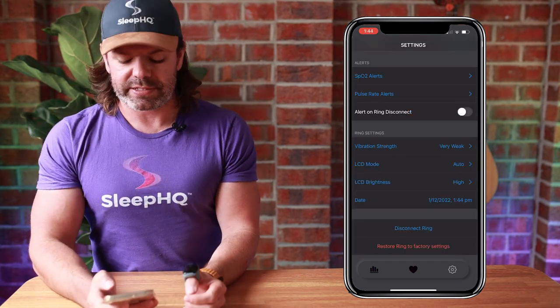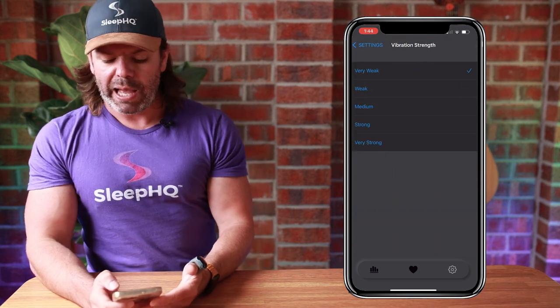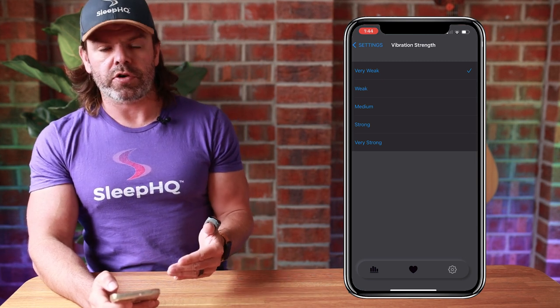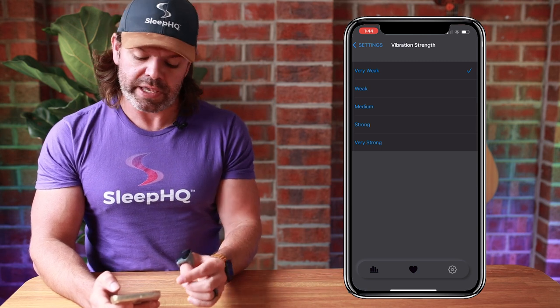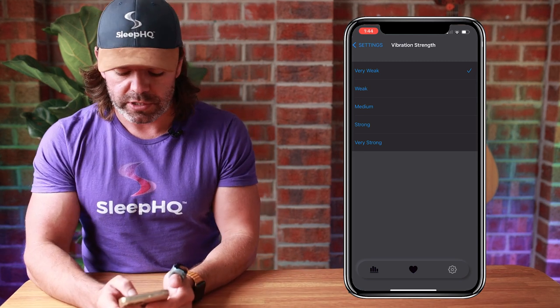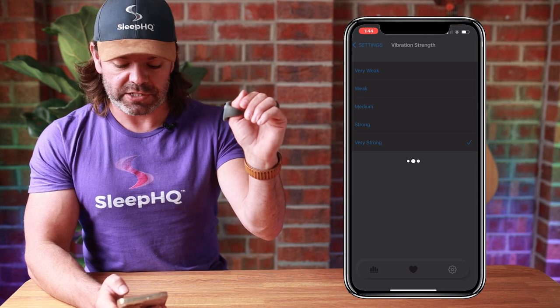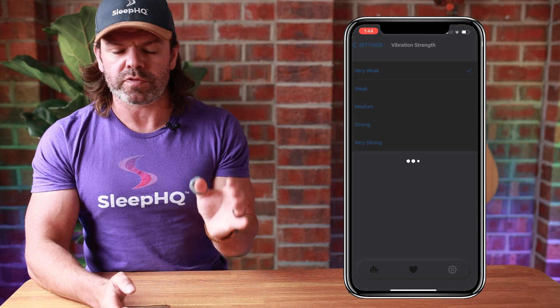Down from that we have the ring settings, starting with vibration strength — five levels from very weak to very strong. If you're someone who's difficult to wake, you'll obviously need a strong to very strong level of vibration to alert you when you've reached one of those thresholds.